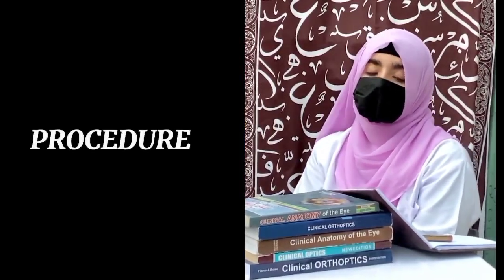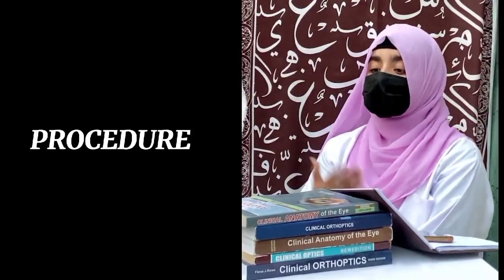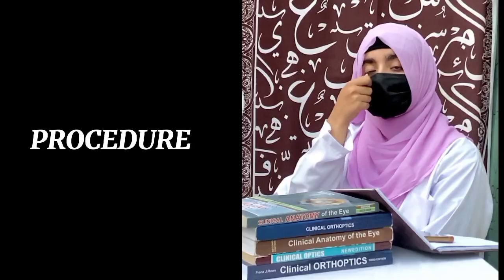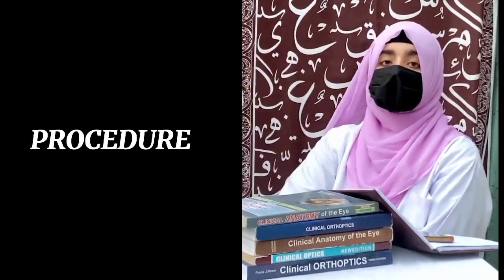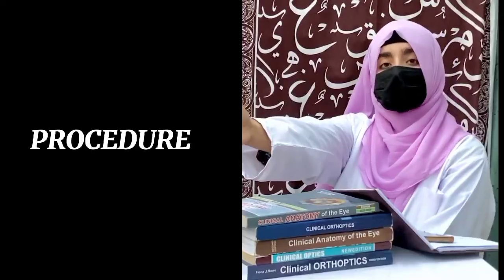Now we talk about the procedure. Tell the patient about the test. The patient should be instructed to fixate on the distant target. The patient's right eye should be examined with the examiner's right eye, with the retinoscope in the right hand, and vice versa. Working distance should be maintained at arm's length. The examiner should keep both eyes open. The examiner should stay as close to the visual axis as possible. The examiner should not obstruct the view of the target.